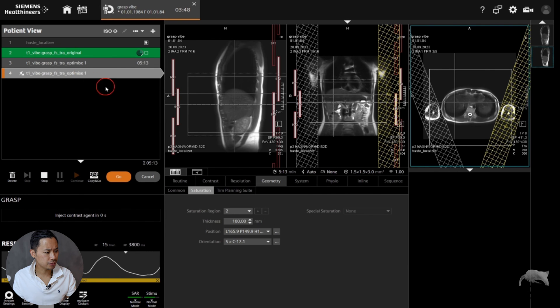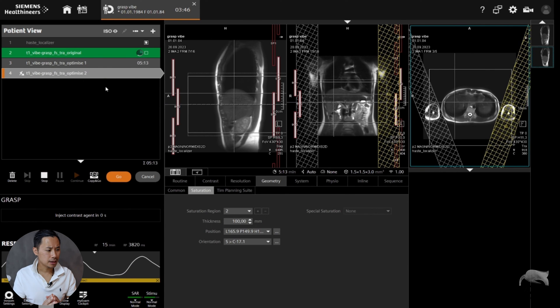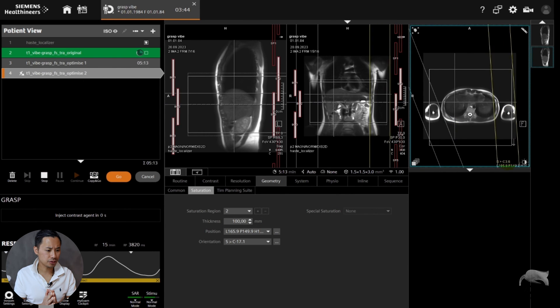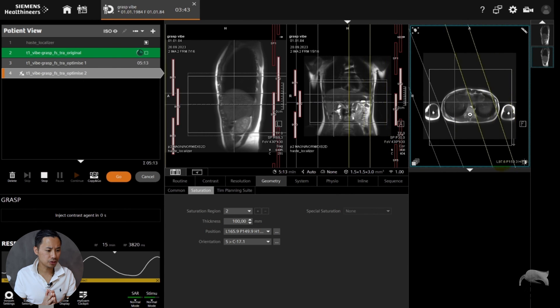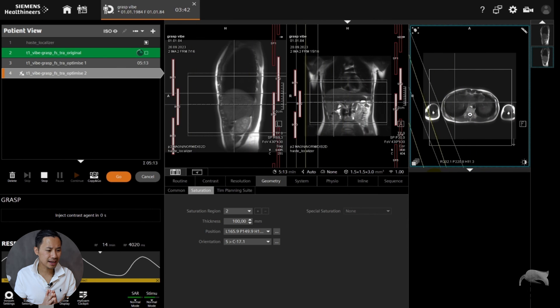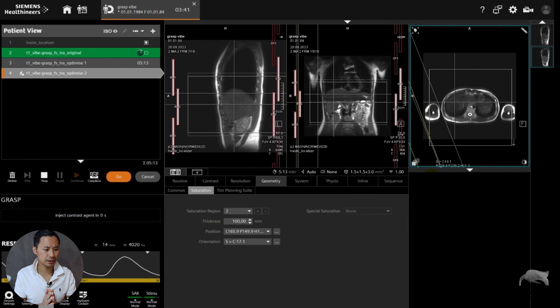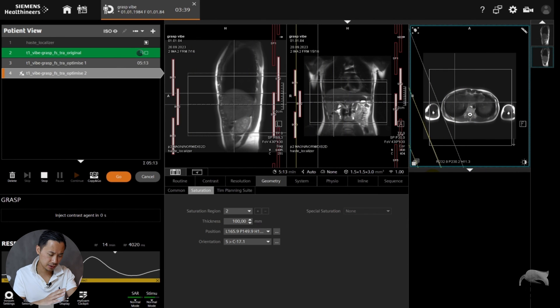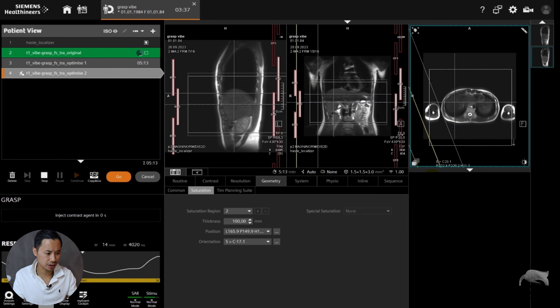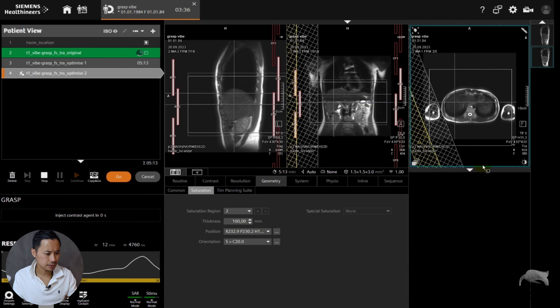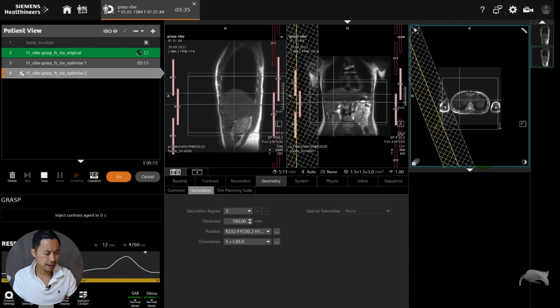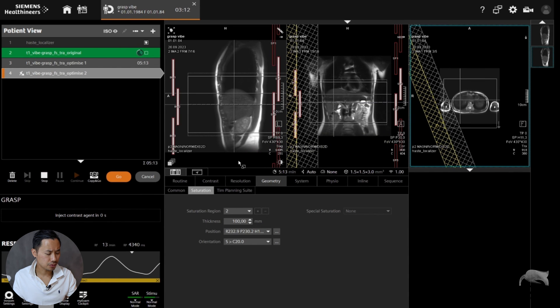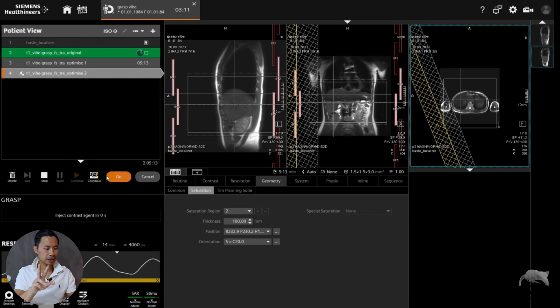Because there's no more room for multiple sats, there's only room for two sats. We're going to do one more and try to optimize number two. In this I'm going to try to put number two next to number one, so I try to totally eliminate the right side at the liver part. So we did three tests and I'm going to show you the results.